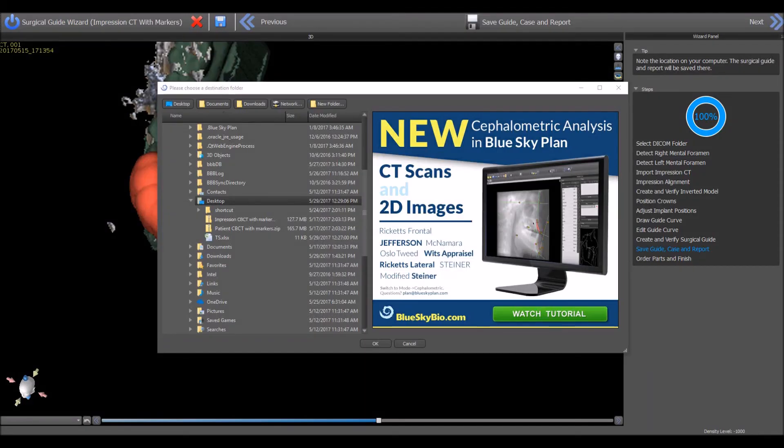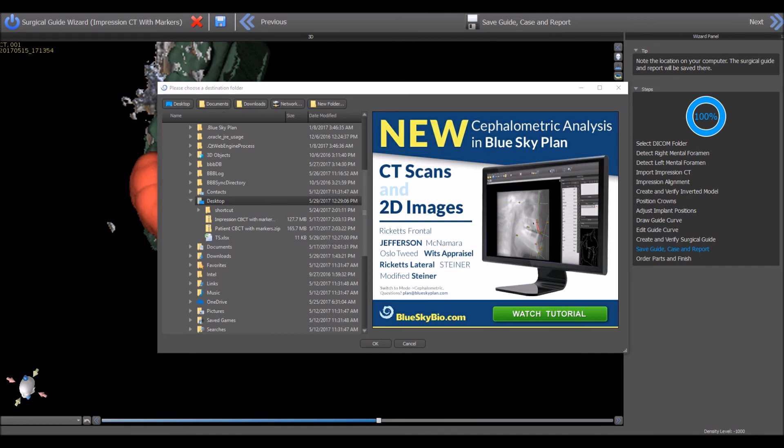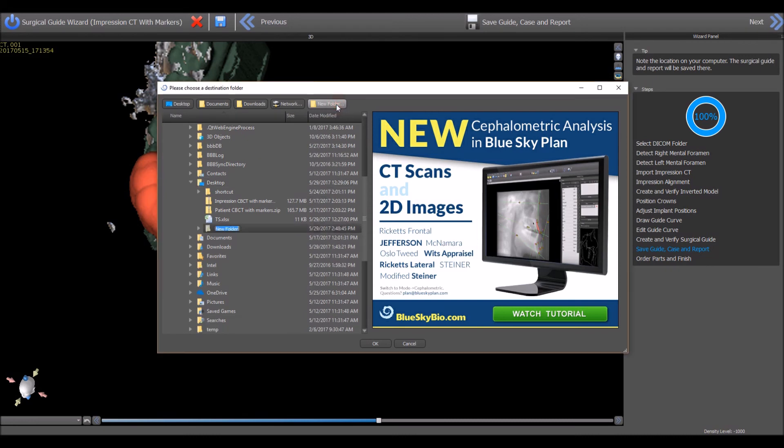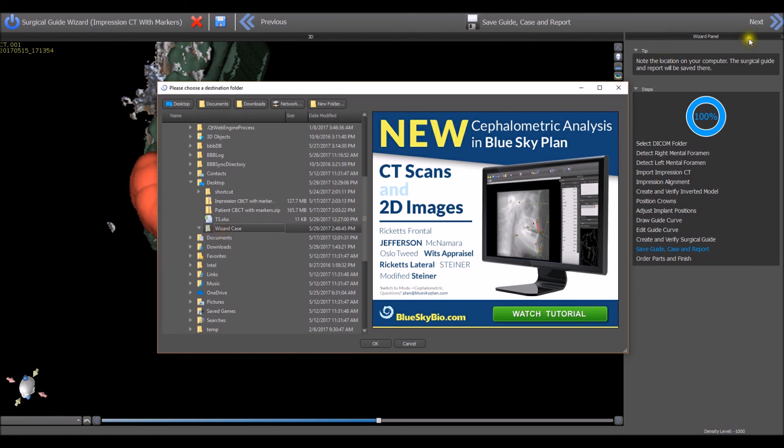The wizard will be saving the currently opened treatment plan, the designed surgical guide, and the drilling report to your computer. Select the folder on your computer to save the treatment plan, drill report, and surgical guide or create a new folder by pressing the New Folder button and naming the new folder. Select the relevant folder and press the OK button.